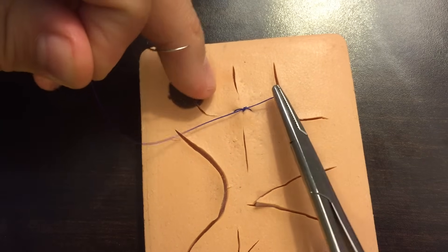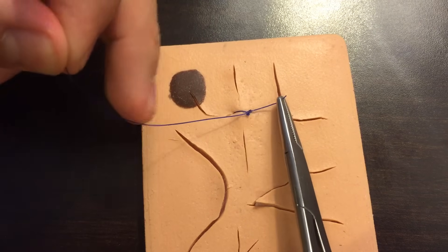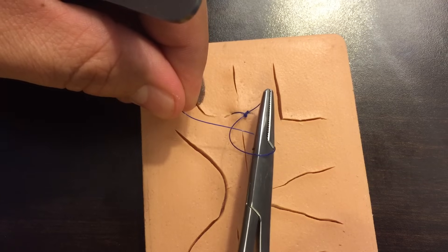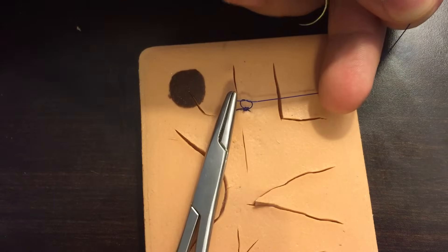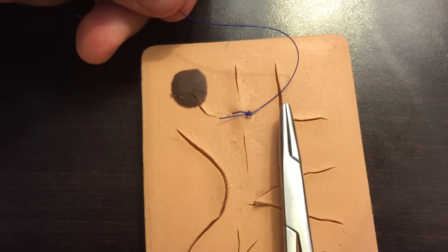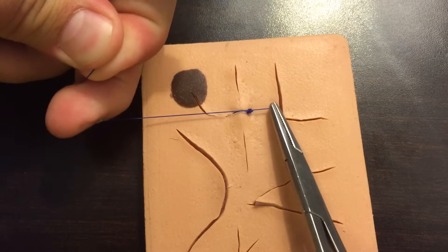Pull it over onto one side. For the next throw, again start with the needle driver in the middle coming over the top — just once this time, since only the first throw needs two wraps. Grab the tail and pull to the opposite side. You need to go back and forth across with each throw; if you don't alternate directions, you're not creating a square knot and you risk it coming undone. Square knots will not slip out on you.